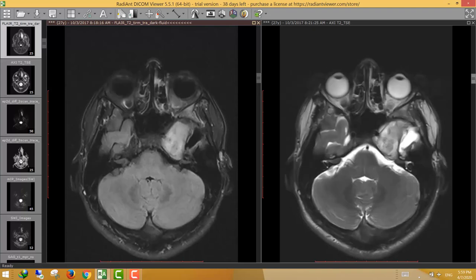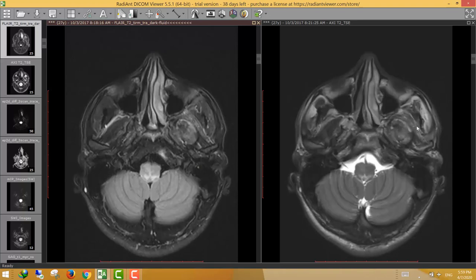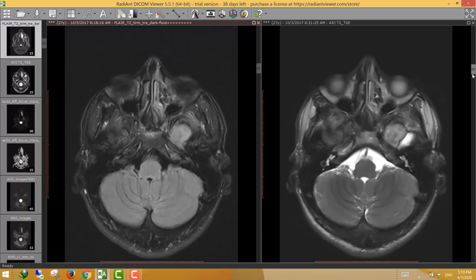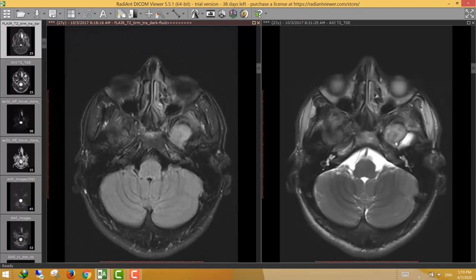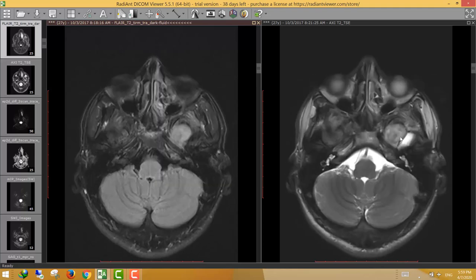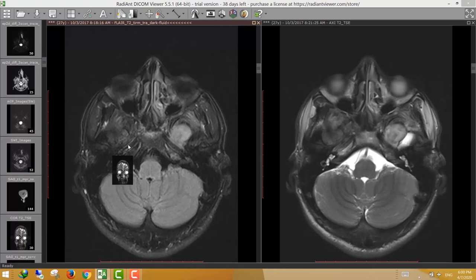We noticed in inferior sections that the region extends inferiorly to the masticator space. We can see the lateral pterygoid muscle, and the lesion is abutting the lateral pterygoid muscle. So the region extends outside the skull to the ipsilateral masticator space. Such extension is very helpful to narrow the differential diagnosis. The region extends from the paracavernous region to the masticator space with no evidence of skull base destruction, suggesting it extends along one of the skull base foramina — here, most importantly, foramen ovale.